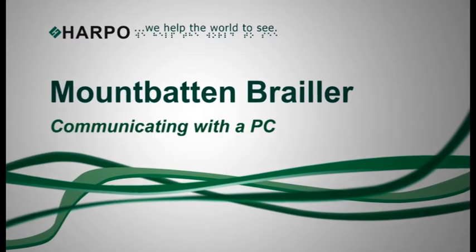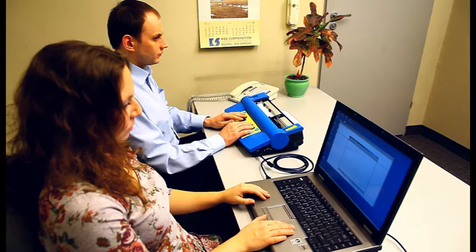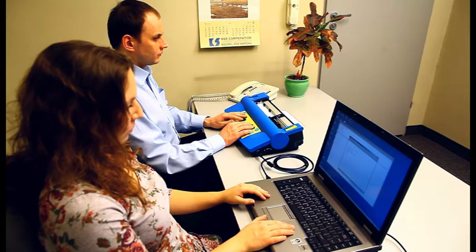Mountbatten Brailler — Communicating with a PC. MBCom is a simple piece of software used to interface with your Mountbatten. It is easy to install and easy to use. MBCom is menu-driven and is fully compatible with all popular screen readers.